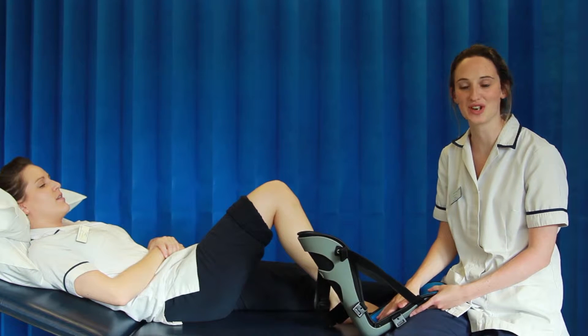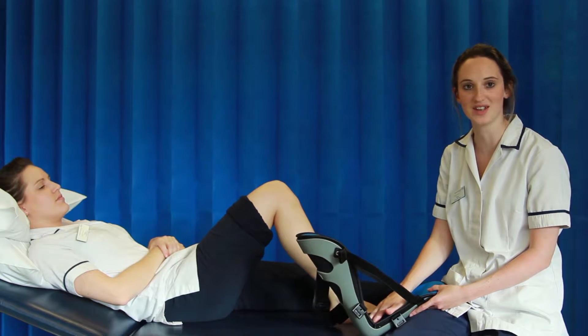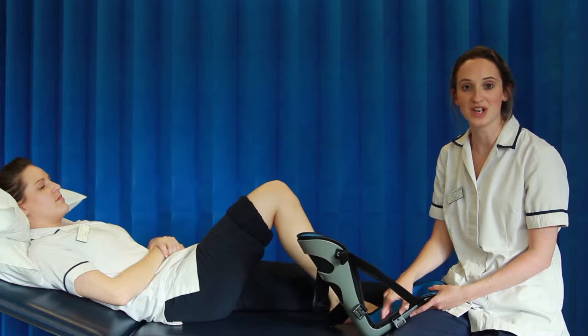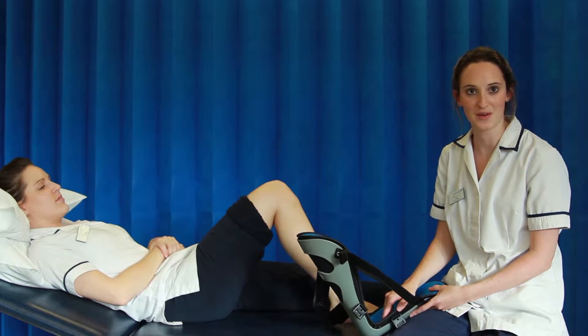This is an educational video to demonstrate how to apply a universal foot orthosis, otherwise known as a UFO splint. This video must only be used under guidance from a physiotherapist.